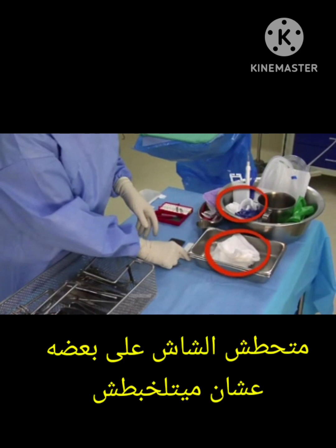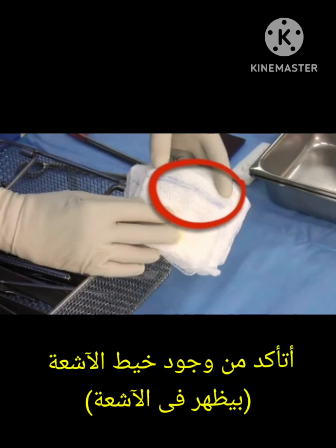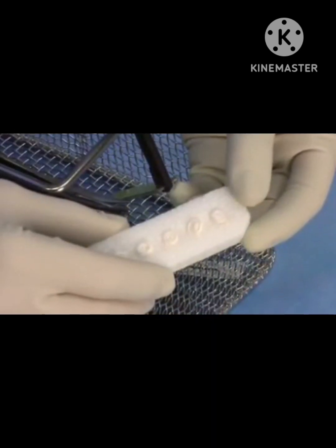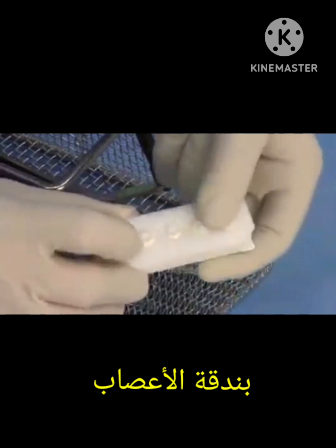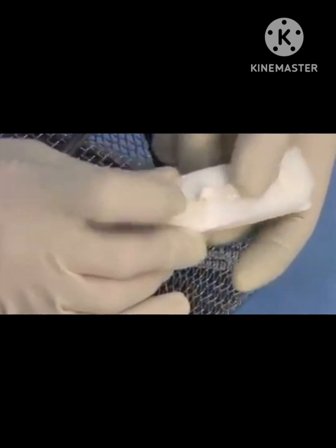Keep the last sponge in your hand and count the sponges back. Place the sponges in the appropriate basin or area. Different types of sponges should be separated so that they do not inadvertently become mixed together. Notice the blue stripe or radio-opaque thread woven into the sponge — all items used during surgery must be radio-opaque to facilitate location by radiography in the event of an incorrect count. Small sponges such as peanuts are counted next.